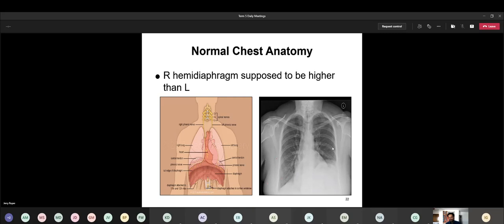So I couldn't find these issues with pediatric patients. I looked and looked and looked. So a lot of these films are adults, but we're just going to assume that the same thing can happen with a child.